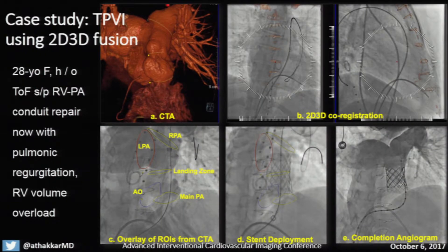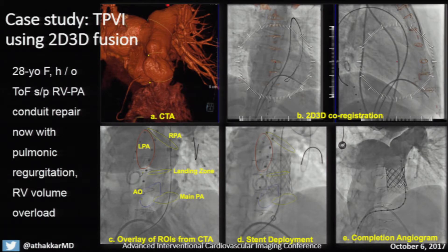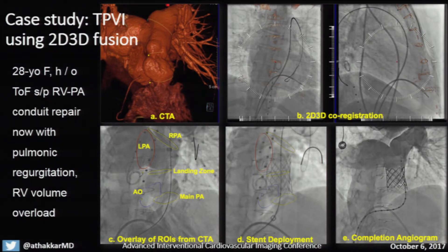This is the 2D-3D workflow. This is a 28-year-old lady with tetralogy of Fallot who underwent RVPA conduit repair and presented with pulmonic regurgitation. Here we have the pre-procedural CT angiogram with the regions of interest marked, and these are our 2D fluoroscopy images. We co-registered the CT angiogram with the fluoroscopy images, which allows us to overlay the regions of interest onto live 2D fluoroscopy.